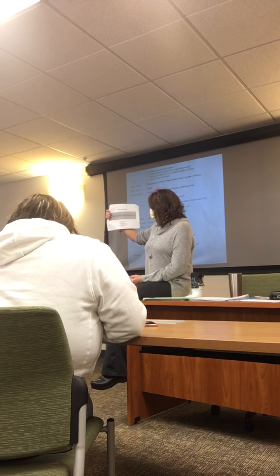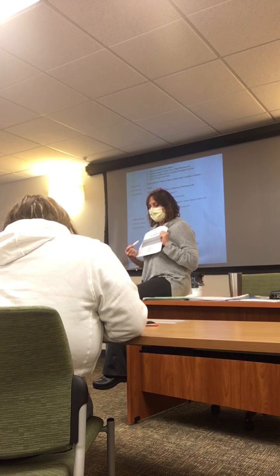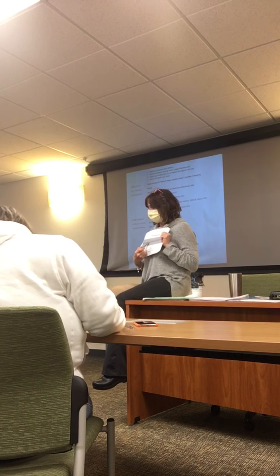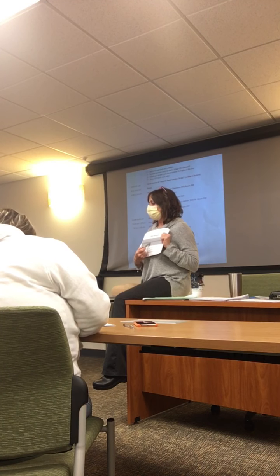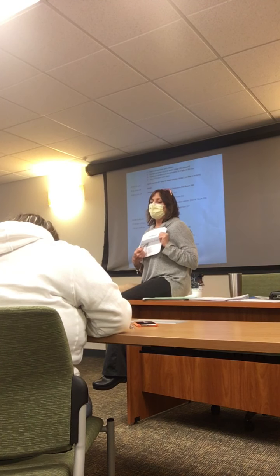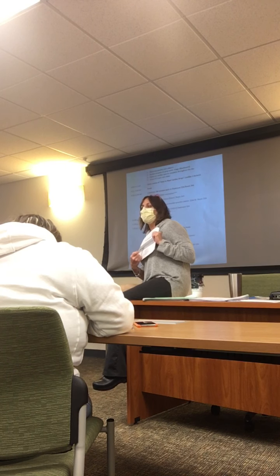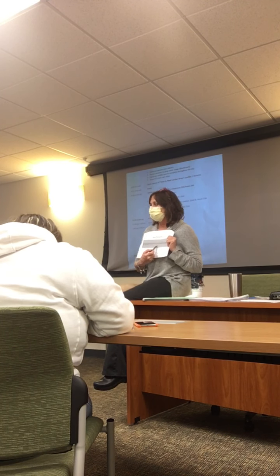All right. So sometimes it's normal. So our P's equal our QRS's. So look at my tracings and look at the P waves before the QRS complex. Do they all look about the same? Yeah. Is there one P wave before every QRS complex? Yep. Do the QRS complexes all look about the same?